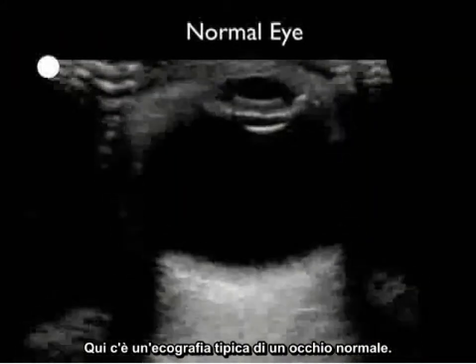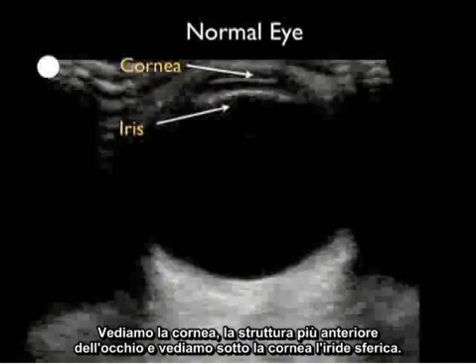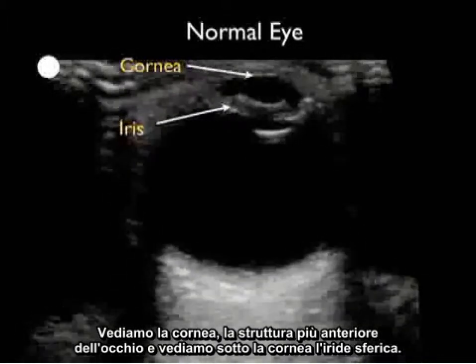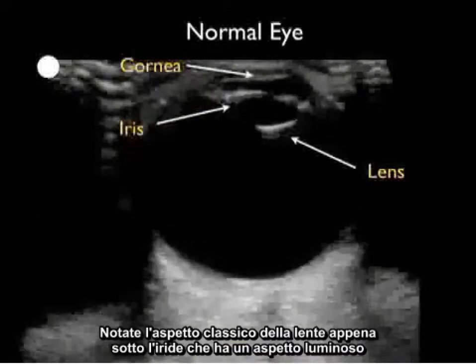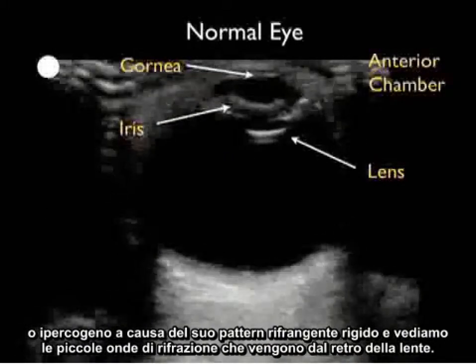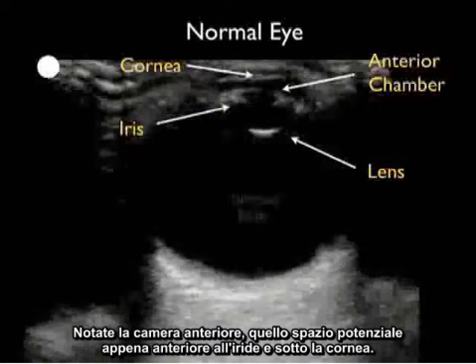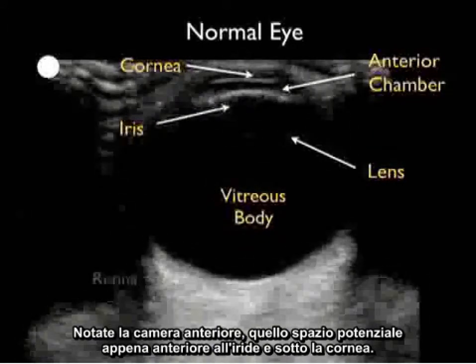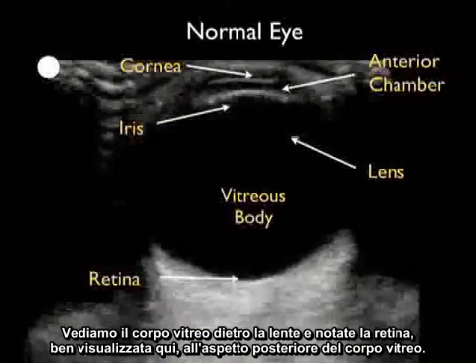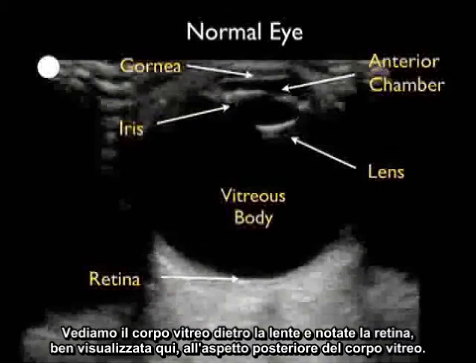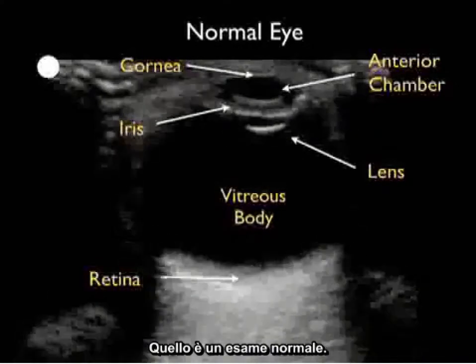Here's a typical ultrasound of a normal eye, taken in the horizontal or side-to-side probe configuration with the probe marker lateral. We see the cornea, the anterior-most structure of the eye, and below the cornea the rounded iris. Note the classic appearance of the lens just below the iris, which has a hyperechoic or bright appearance due to its hard refractive pattern, with refraction waves coming off the back of the lens. Note the anterior chamber — that potential space just anterior to the iris and below the cornea. We see the vitreous body behind the lens and note the retina, well seen here, at the posterior aspect of the vitreous body. This retina is well tacked down and in opposition to the posterior aspect of the eye — that's a normal examination.